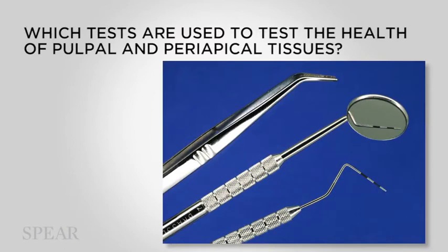Yeah, absolutely. I mean, that kind of brings us to the next step, which is doing the tests that are required to do our pulpal and apical diagnosis. And those are the tests that we use: your palpation, percussion, and the vitality test. These are ultimately the tests that we apply to the tooth in order to find out the condition of the pulp and the apex. Let's just go through this systematically. So we'll do palpation first. Okay, and then we'll do percussion.